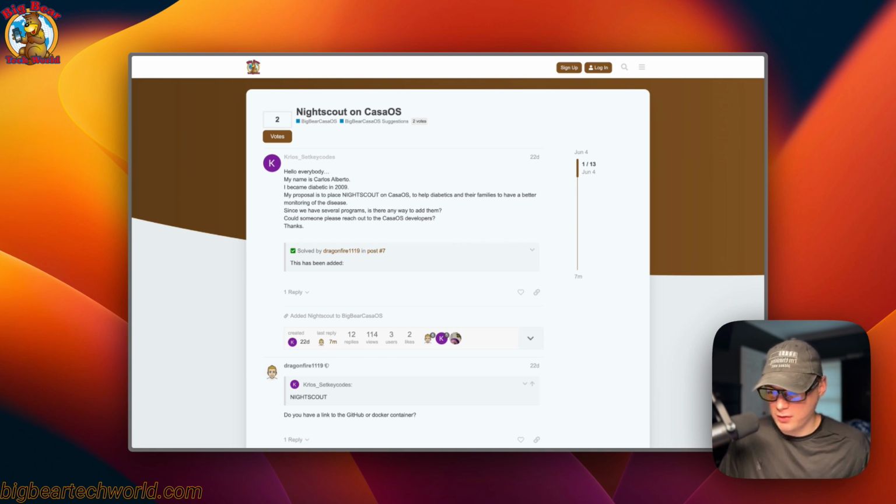But if for some reason something's not working for you, go on the Big Bear community and start a post and let me know about the error that you got or any logs or anything like that so I can try to get it fixed as soon as possible.